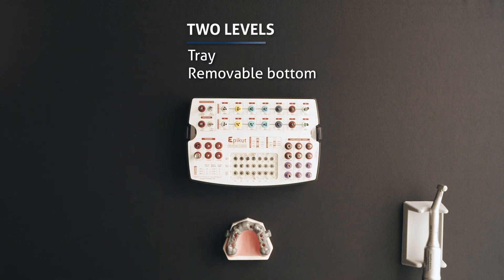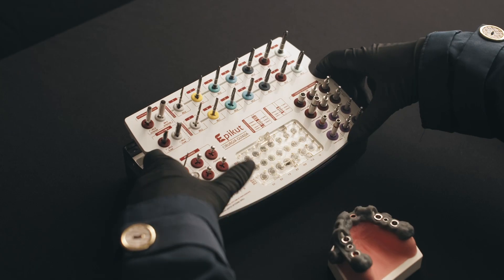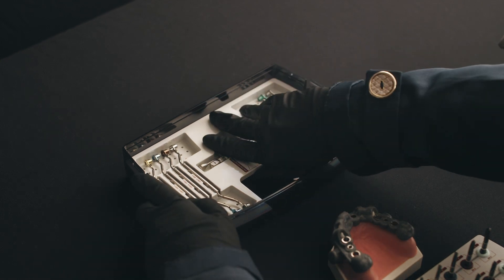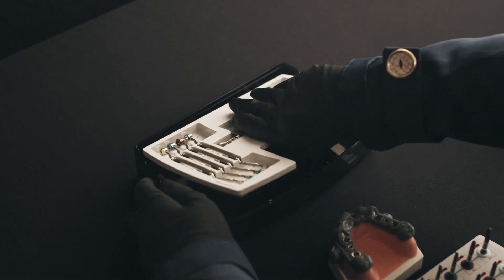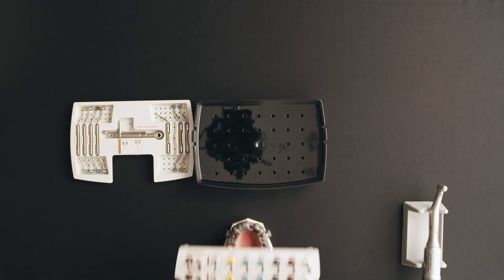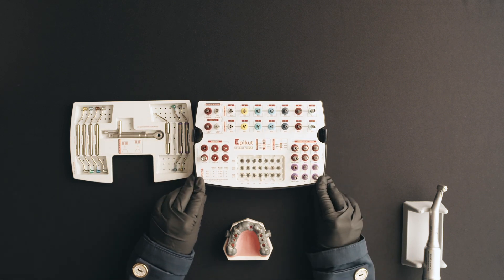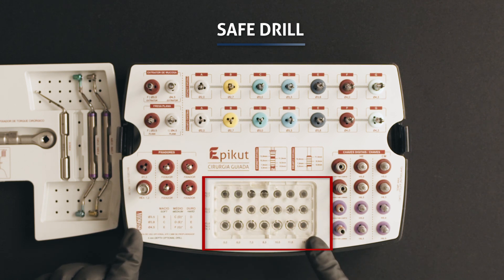The kit has two levels: the tray and the removable bottom. Lift the tray out of the kit, remove the bottom, and put the tray back on its base. The kit also includes the drill stoppers, integrated into the tray.